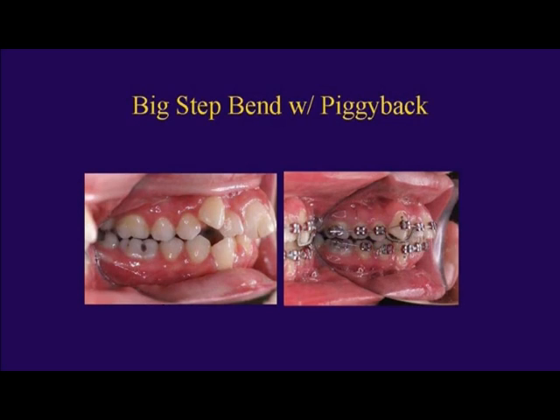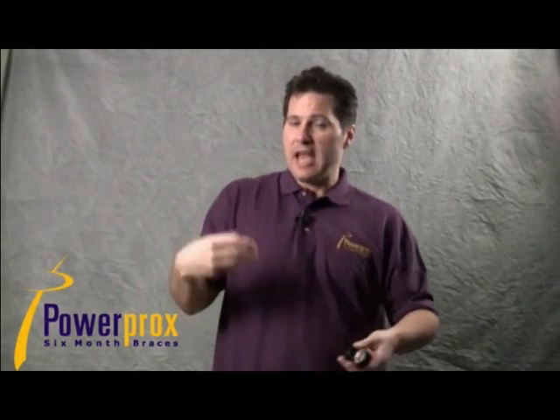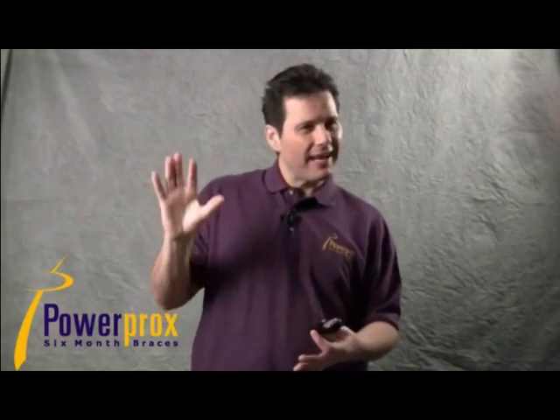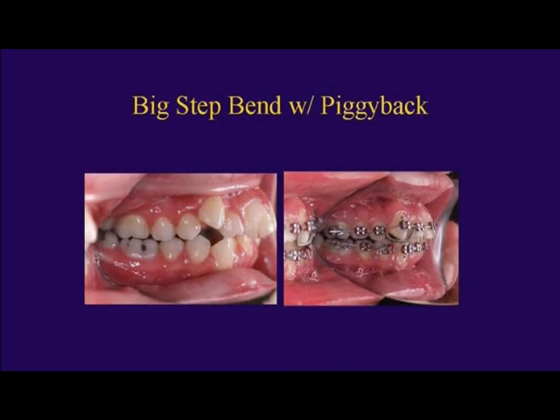And here's a clinical example of where we have done that. We've just made that big step bend and placed our nickel titanium arch wire to get that canine down the rest of the way. It was still a touch too high to go with continuous arch wire, so we made that big step bend and then brought that tooth down. You don't have to use this big step bend wire in every high canine case, but it's a nice trick to have when that canine's still a little bit too high. You don't necessarily want to go with continuous, but with the piggyback, the canine cusp tip is hitting that main arch wire, rendering the piggyback ineffective.